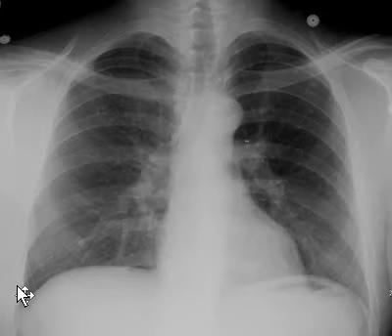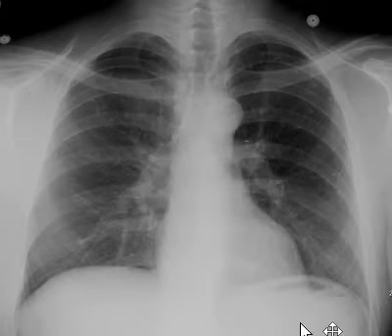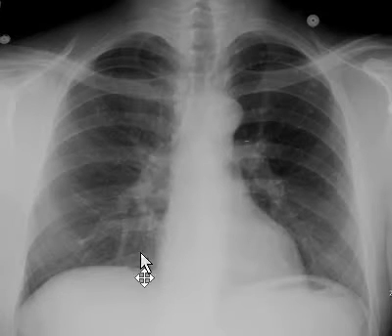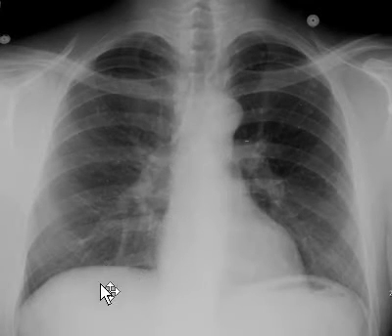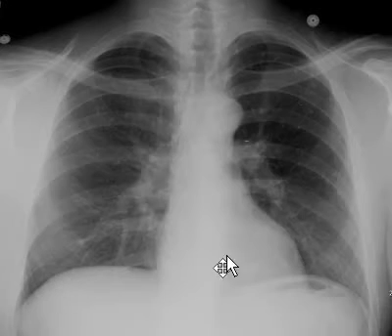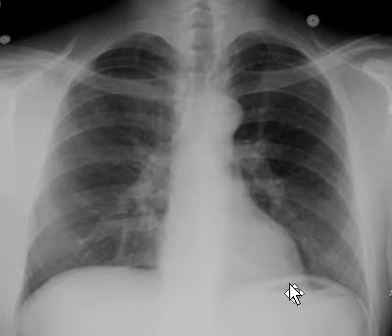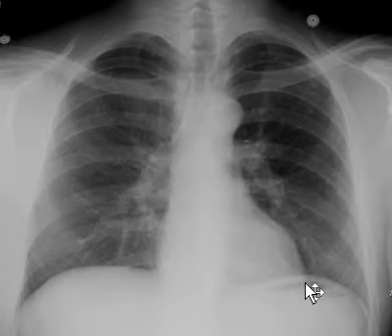Right and left costophrenic angles are clear. There is no effusion. There is no sign of collapse. Subdiaphragmatic areas are also clear. This air is in the stomach.